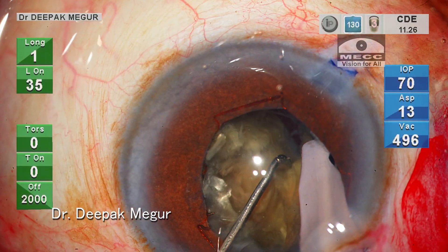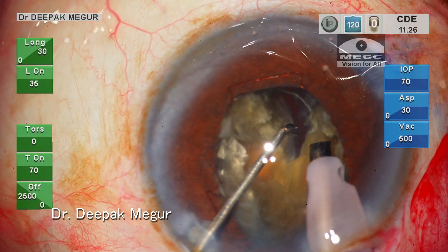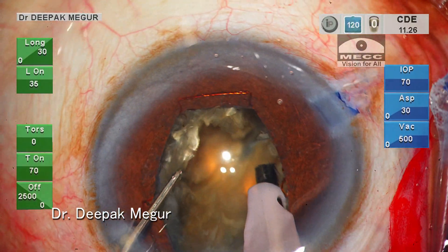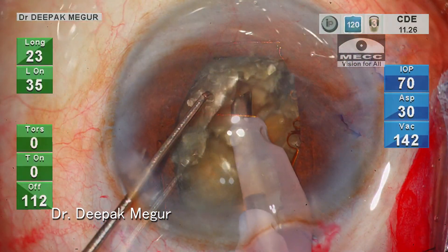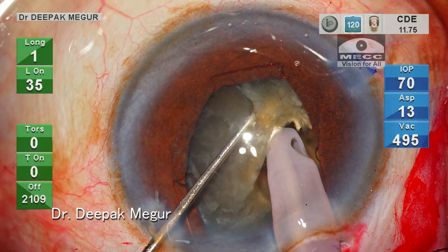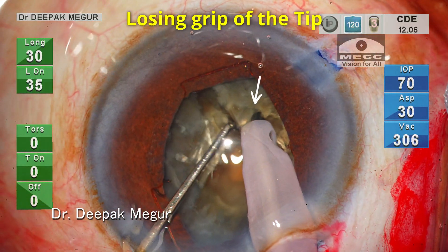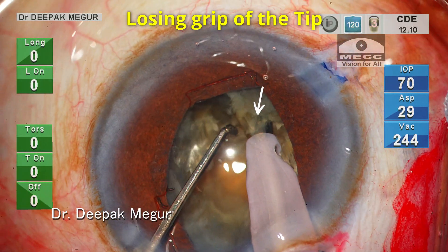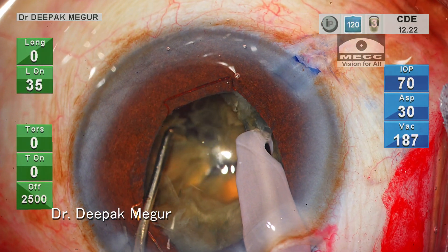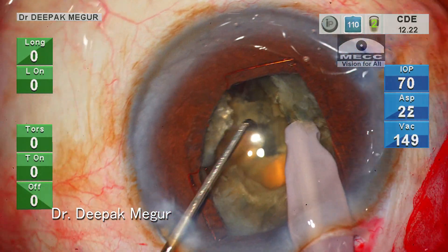The crack of the posterior plate is initiated but it hasn't traversed the entire length — no problem with that. The key is to continue dividing. The nucleus is rotated, the tip is buried deep, the vertical chop is performed followed by lateral separation. The grip of the tip gets loosened during lateral separation. A short burst of energy re-engages the nucleus. The lateral separation maneuvers at deeper planes ensure that complete division has occurred.